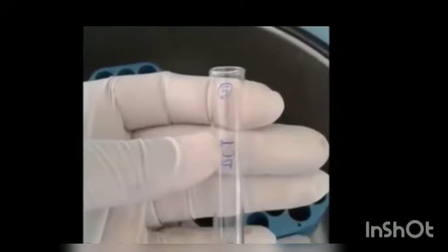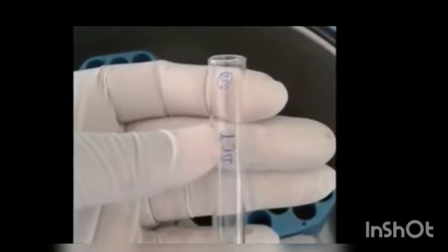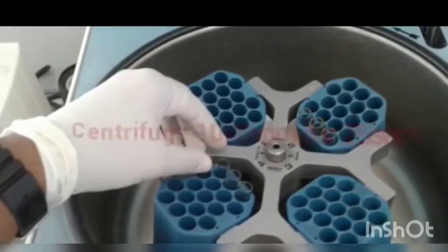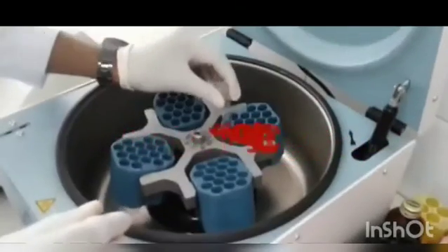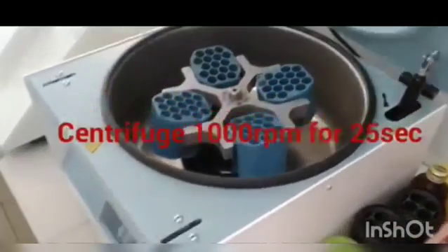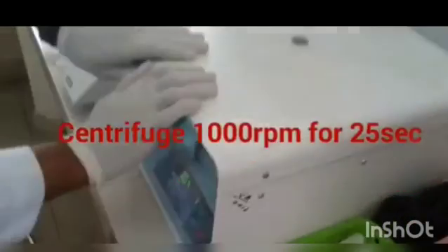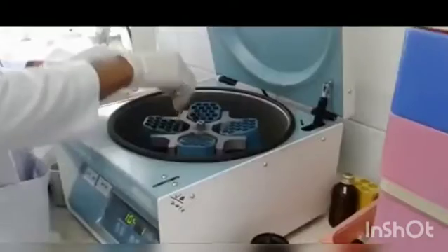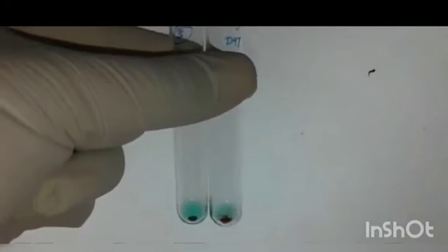And then, as you can see on the slide, it is liquid. So you have to centrifuge it again at 1000 rpm for 25 seconds to look for the agglutination. After centrifuging, you have to observe it under proper lighting.